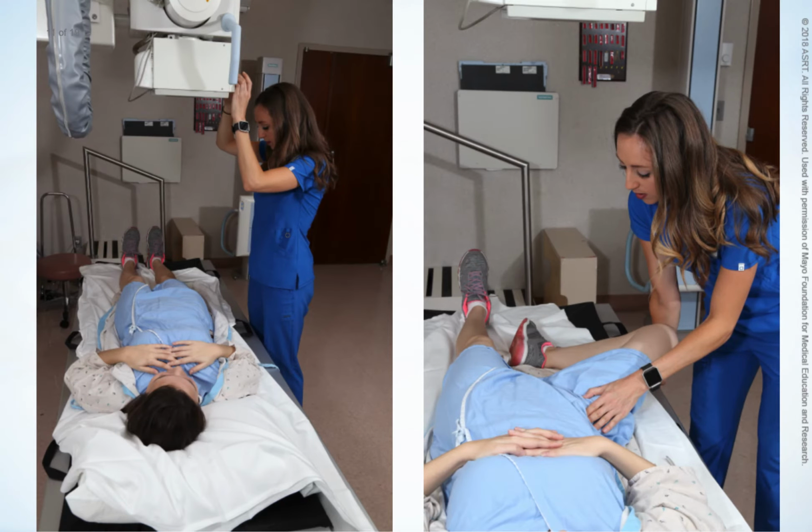A lateral hip projection, using the Lowenstein and Hickey methods, is not used for patients who have a suspected fracture or pathologic condition. In these instances, an axiolateral or modified axiolateral projection is performed instead. Positioning for the lateral projection of a unilateral hip examination begins with the patient lying supine on the radiographic table. The patient places their arms in a comfortable position outside of the field of view.